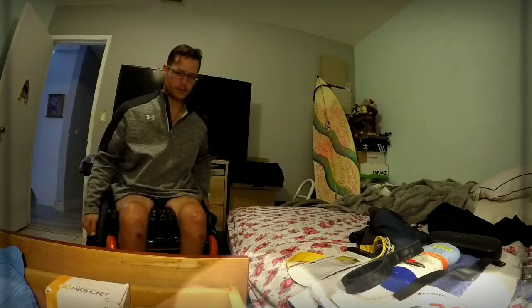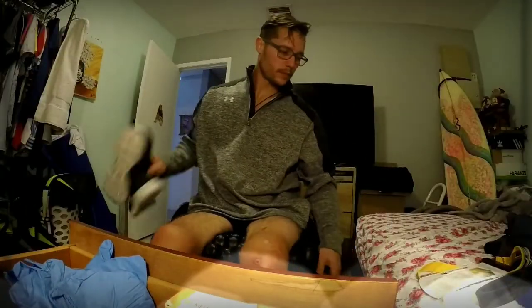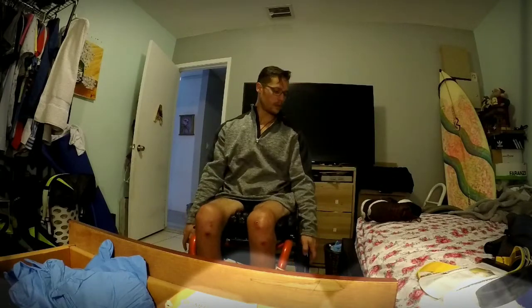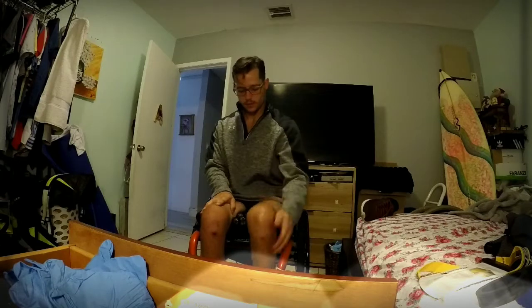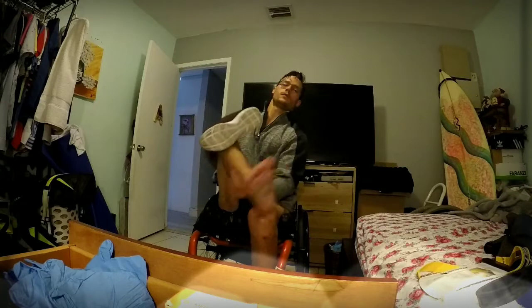Feels pretty good. Now let's just have a little test try with the shoes on. I don't really use the brakes too much, but the floors in my house are not even, so brakes are kind of essential, to be honest. One shoe. It's pretty nice, feels good. Two shoe.